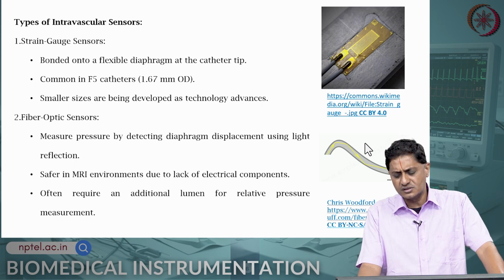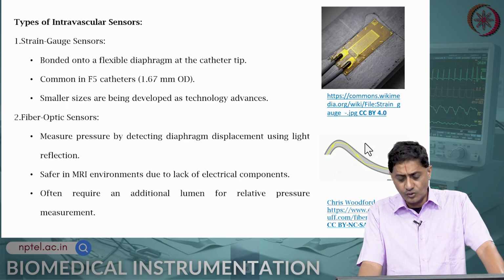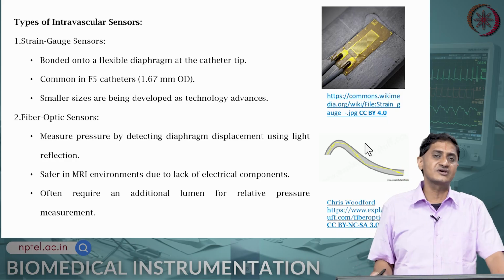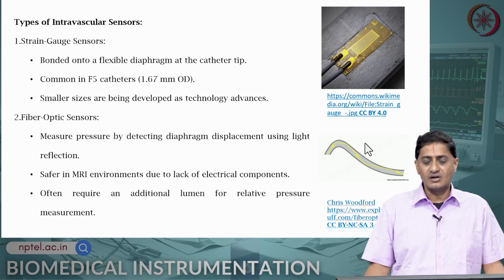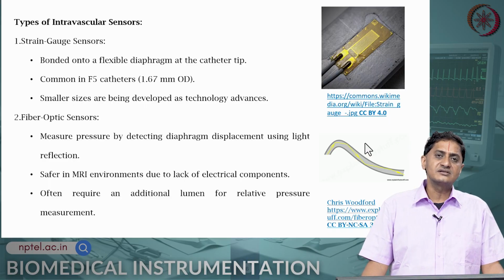It turns out that we could measure the change in the voltage, and we could essentially relate the change in this voltage directly to the change in the resistance, and the change in the resistance is directly related to the deflection that is causing this change. If all these relationships are linear in a range, we could relate the change in the voltage to a change in the pressure.